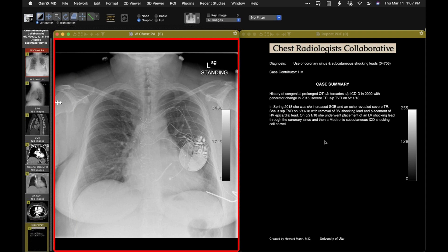So in case you come across those things, it's worth knowing about that. I'm seeing more subcutaneous leads also put in in a left parasternal distribution. When I see that, it's just a single lead, subcutaneous in the midline over the sternum. I think that's a relatively new device, but I do see that occasionally — a single defibrillator lead in the subcutaneous tissues of the chest wall. I see that maybe once or twice a year.